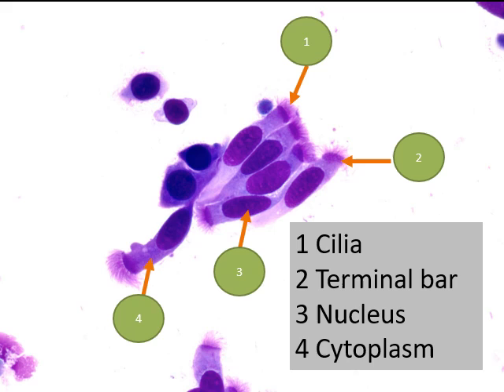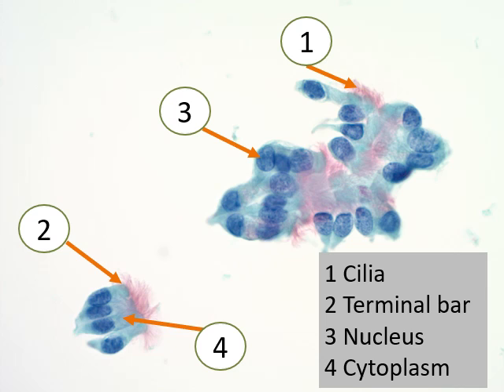Here is a DiffQuik stain — used by cytopathologists — showing the beauty of ciliated columnar cells. These are the normal cells lining the inside of your windpipe and breathing tubes. They have characteristic hair-like cilia at the top. Changing to a Papanicolaou stain — named after the same person as the Pap test — the colors change but the cells are the same. Again: cilia, terminal bar, nucleus, and cytoplasm are labeled.